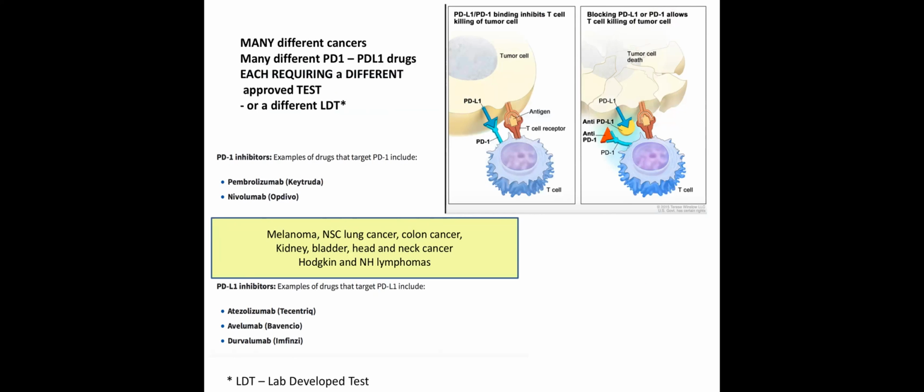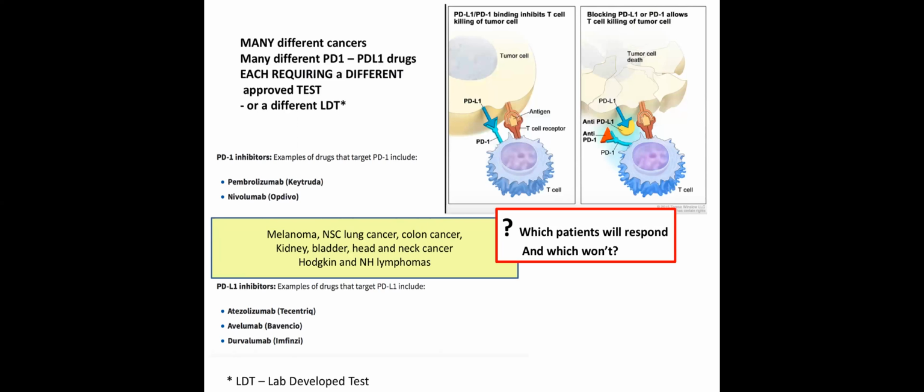Put it another way, in simple terms, with an older test like HER2 for breast, the actual scoring mechanism does not apply in the same manner to HER2 for gastric. So that produces a really complicated problem for pathologists.